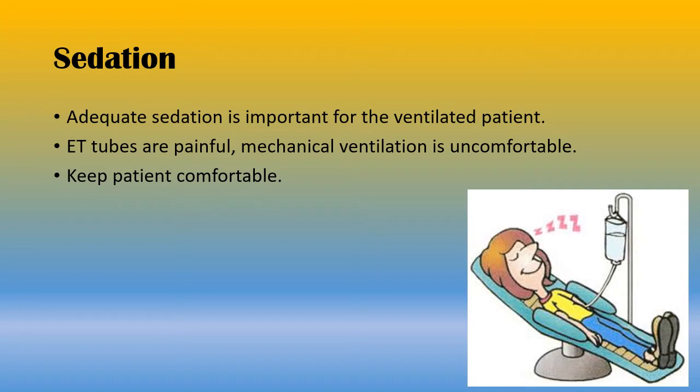Adequate sedation is really important for your ventilated patient. Endotracheal tubes are painful. It hurts when they go in. It hurts when they're in there. That comes from patients that have not been adequately sedated. And mechanical ventilation is uncomfortable. How would you like somebody forcing air down into your lungs and expanding your chest? It would not be real comfortable. So you want to keep the patient comfortable. Getting a good physiologic tidal volume and respiratory rate is the first step to that. Once you have that complete, the patient will require minimal sedation. Research and best practice has proven that.